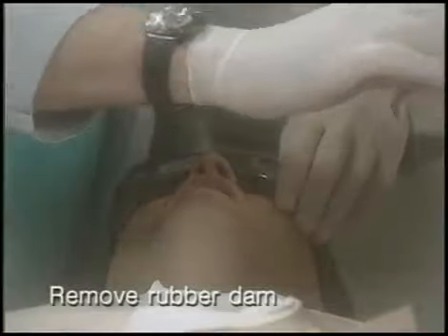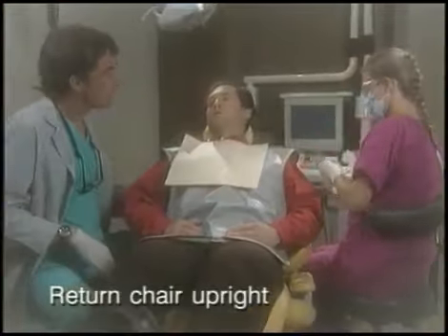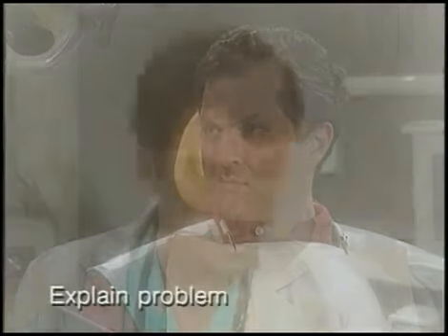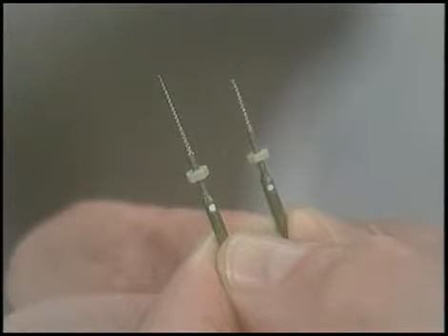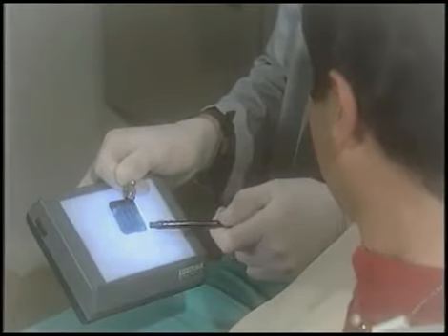If unsuccessful, remove the rubber dam and return the patient's chair to the upright position. Having the patient at eye level lessens their sense of vulnerability. In a clear fashion, explain that we have had an unfortunate event. I have broken an instrument in your root. A good way to convey this concept is to show the patient the remaining file segment next to an unbroken file. An X-ray can also be helpful in this situation.